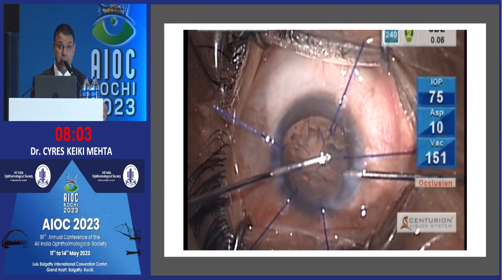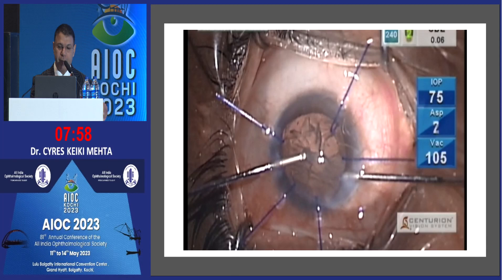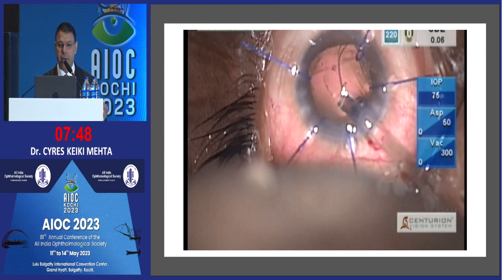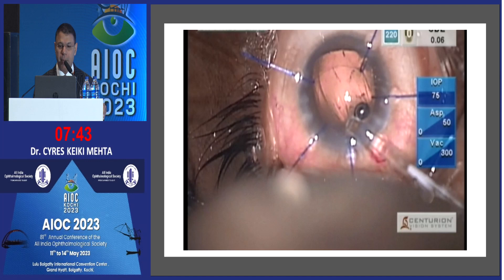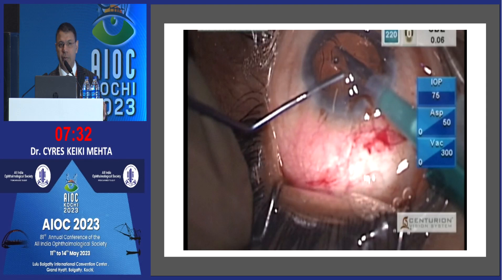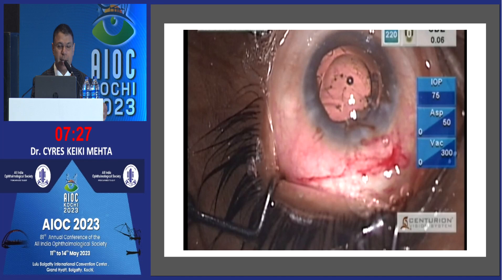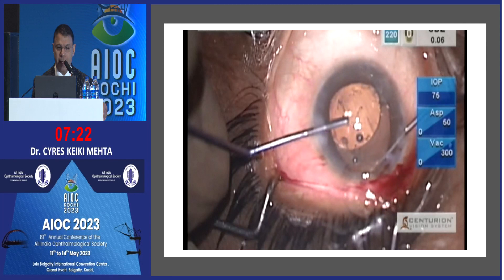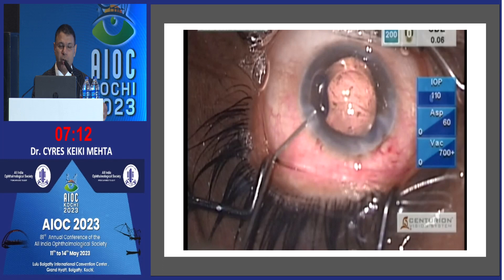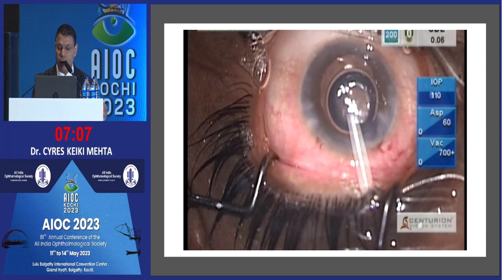Because if you dislodge the bag, getting the hooks back may be difficult. So you slowly peel the cortex from the periphery to the center using low vacuum and low parameters. Now it is time to inject the capsule tension ring — preloaded rings are available from many Indian companies. This was a PMMA ring from a company called OfTech which goes in like butter and will never snag the capsular bag. In goes the IOL — I tuck it into the bag and see that it is sitting nice and stable. At any sign of zonular laxity, I will think about passing a suture through the haptics and fixing it to the sclera, but not now.